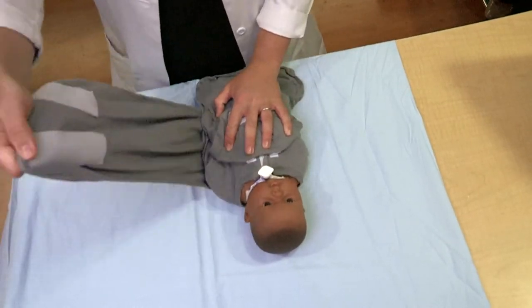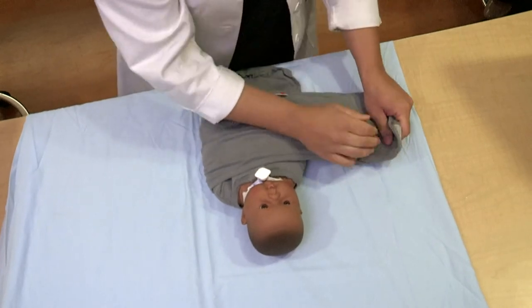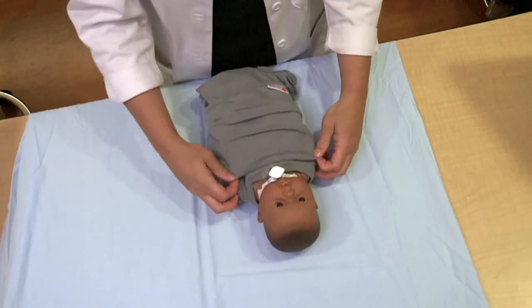Close the straight wing of the swaddle, ensuring that the wing is 2 inches below the baby's shoulders. This will prevent the swaddle from riding up.